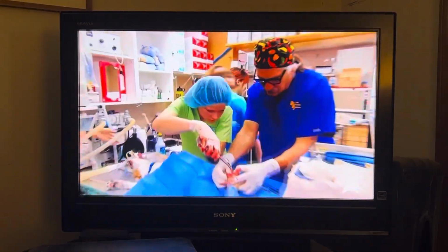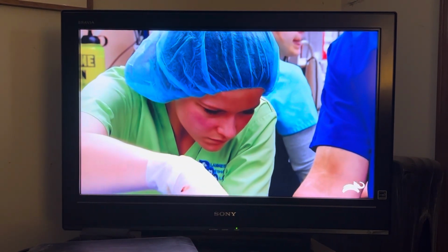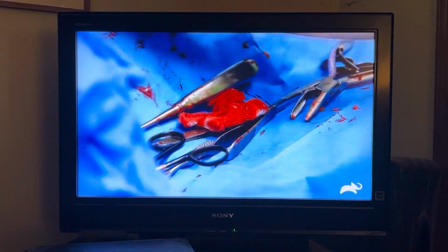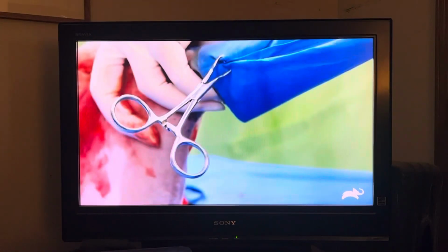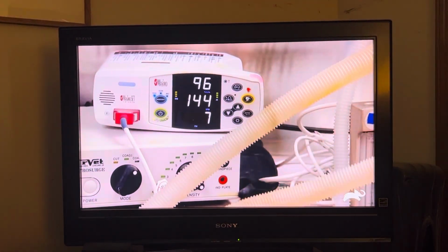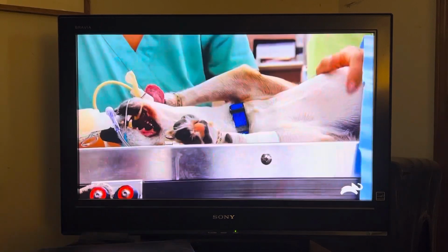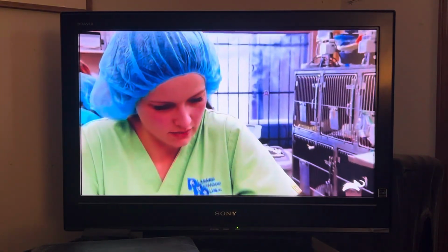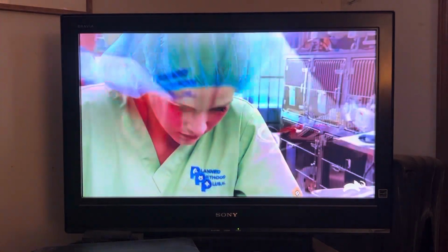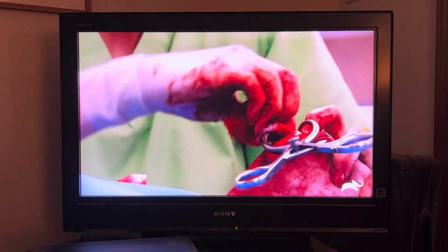Now that she's opened up Tucker's knee, Dr. Amy can remove the torn part of his ligament. I definitely think my skill level has raised since being here. You know, we get to do so much. She's not afraid to learn things. That's the whole point. The mere fact that she is interested in doing soft tissue and bone surgeries is very impressive. Doing fine, I would say. So far, getting ready to start placing the band now.